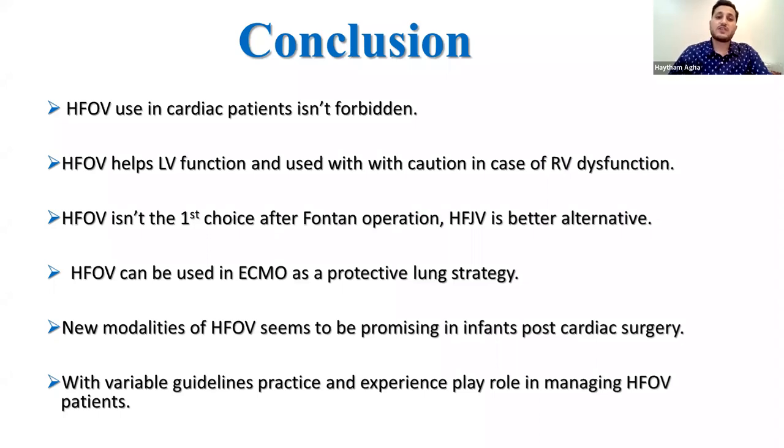High frequency oscillatory ventilation is not the first choice after Fontan operation because this is passive shunting. And if it's mandatory to use high frequency ventilation, high frequency jet ventilation is a better alternative. High frequency oscillatory ventilation can be used in ECMO as a protective lung strategy if you find that conventional mechanical ventilation is subjecting the patient to barotrauma.